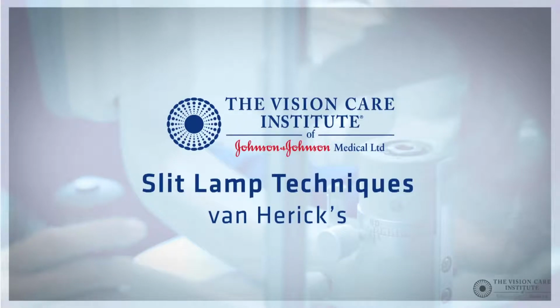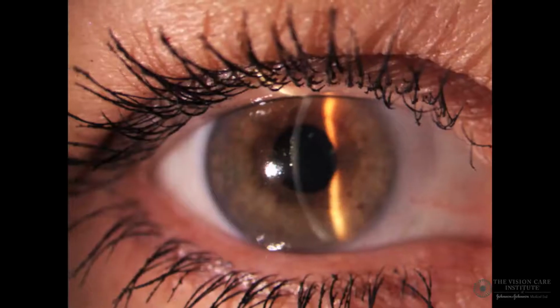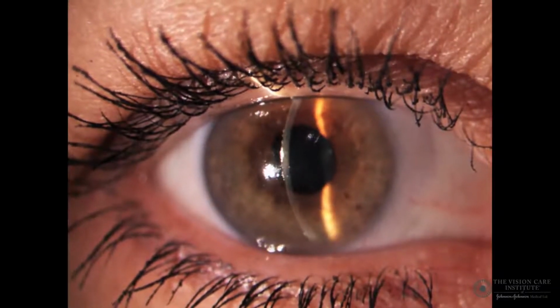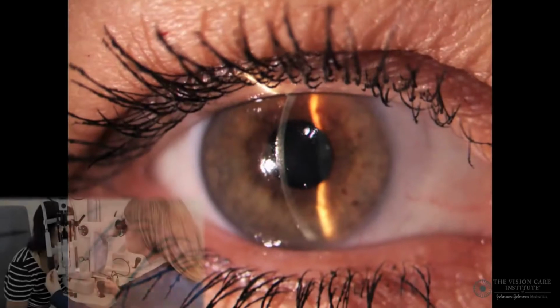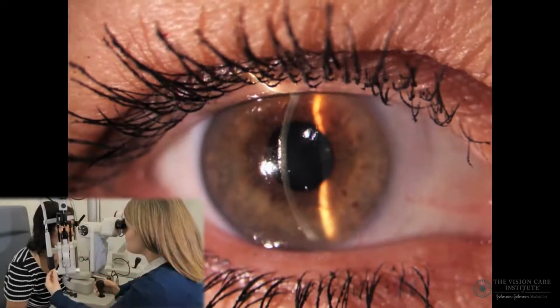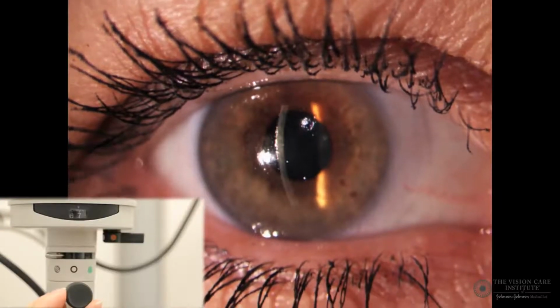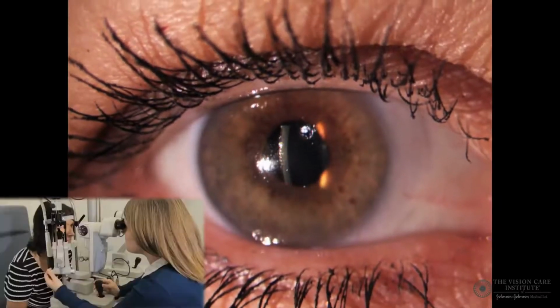In this technique, to begin with, we form a nice clear section at the apex of the cornea as shown in here. Once we have this, it is a good idea to reduce the height of the slit so that it is about 3 to 4 millimeters in height. This will be helpful at the point of assessing the chamber angle.